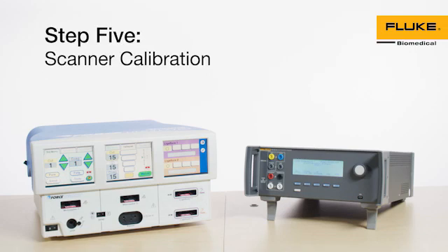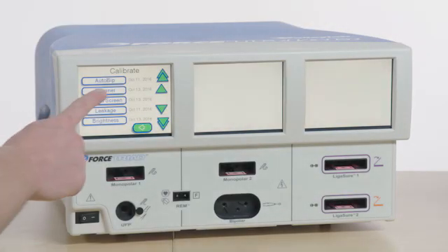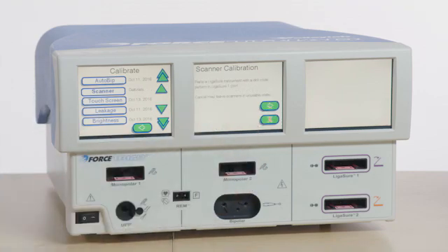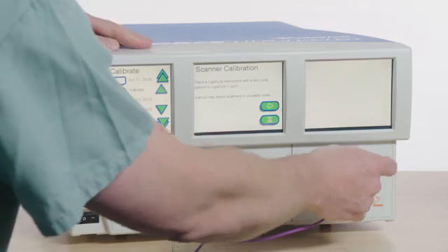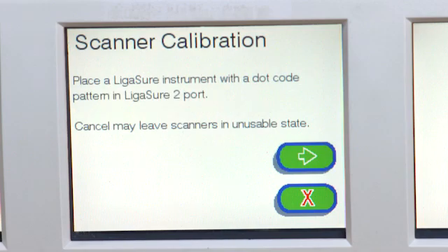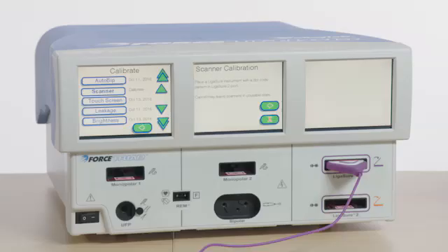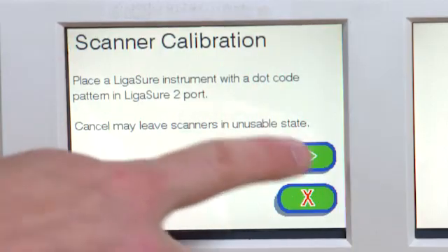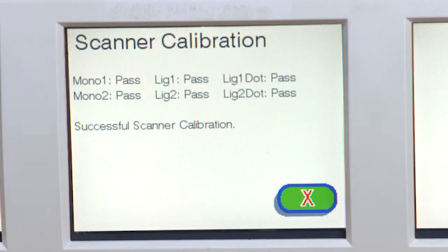Step 5: Scanner Calibration. This requires a LigaSure instrument with a dot pattern on the connector. A barcode connector won't work. To perform this test, select Scanner from the Calibrate menu and press the green arrow. Follow the on-screen instructions and then select the green arrow. When the on-screen calibration instructions have been completed, select the red X to exit.